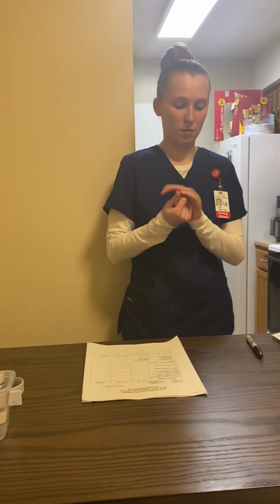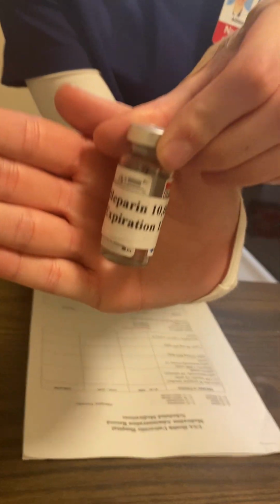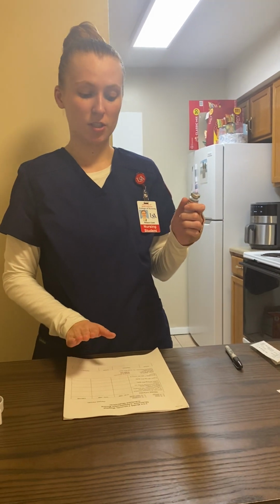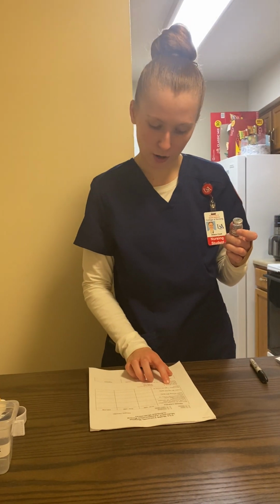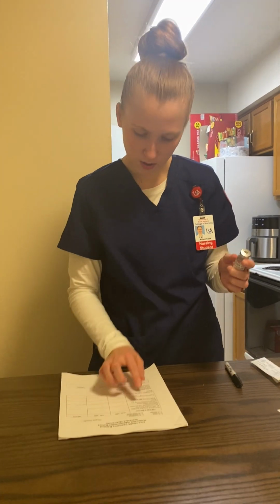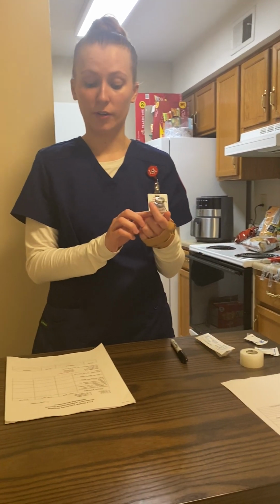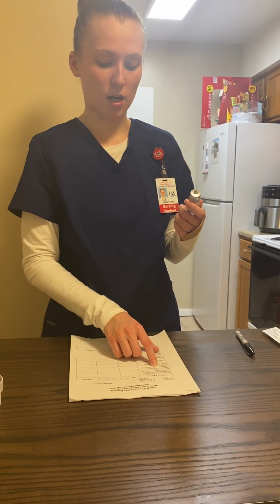I'm going to perform hand hygiene, and grab my heparin vial. This will be the first check for our 7 rights of medication administration. Our patient is Jaguar J. Jones, and looking at the medication order, we have heparin, 5,000 units. Now the vial is 10,000 units per milliliter, so we'll be drawing up half a milliliter to account for the 5,000 units in the order. This is a subcutaneous injection.